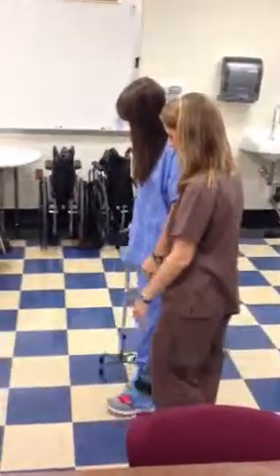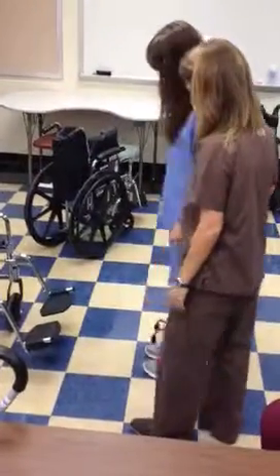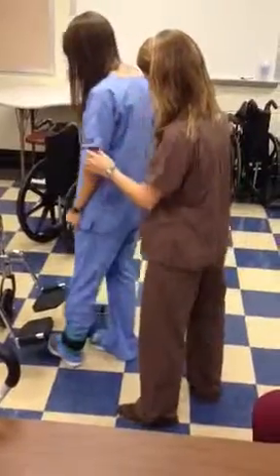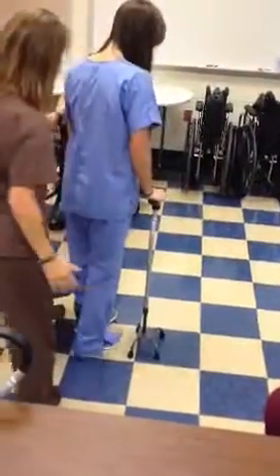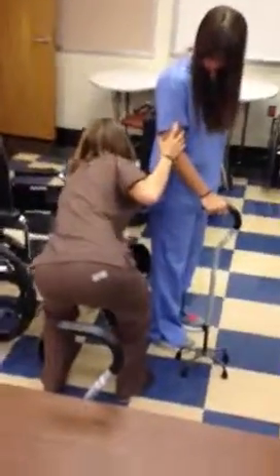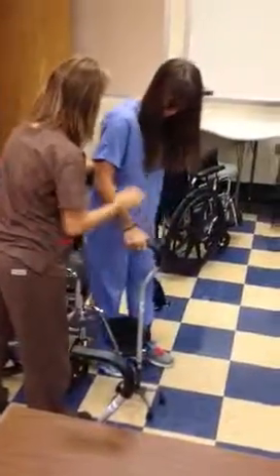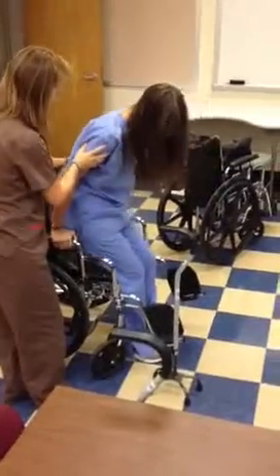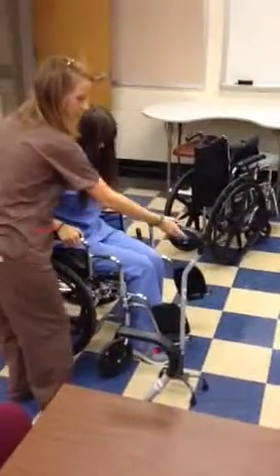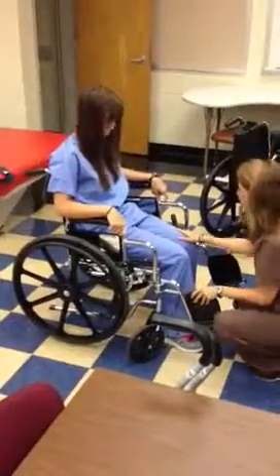Approach our wheelchair, sit down. Let me pull up these pedals for you so you can back up some more. Find your armrest so you can lower yourself nice and slow. Good job. Are you in there good, comfortable?